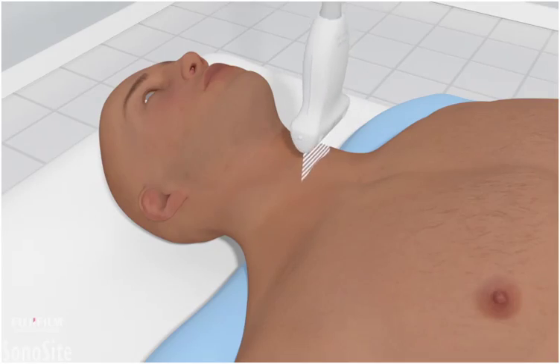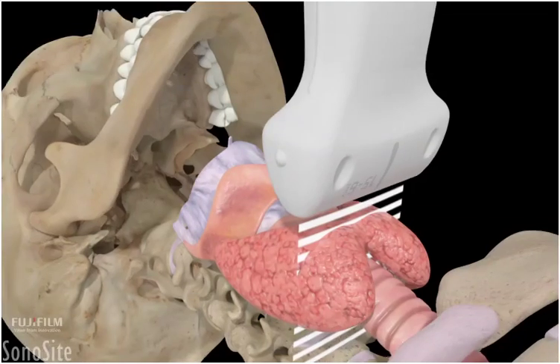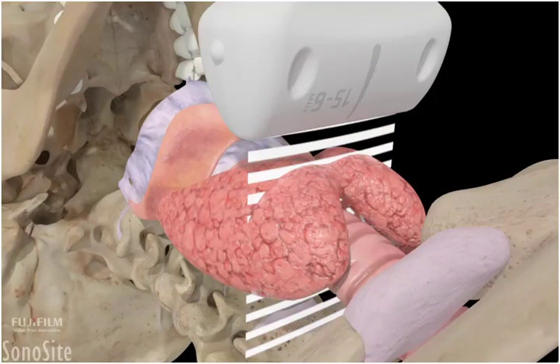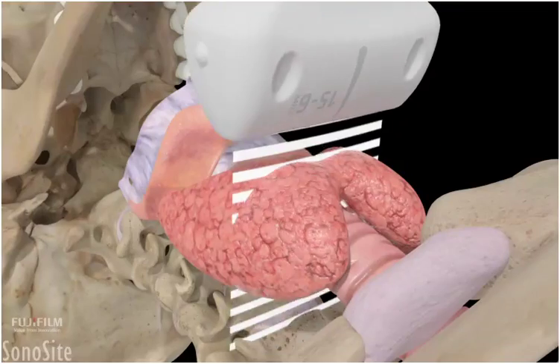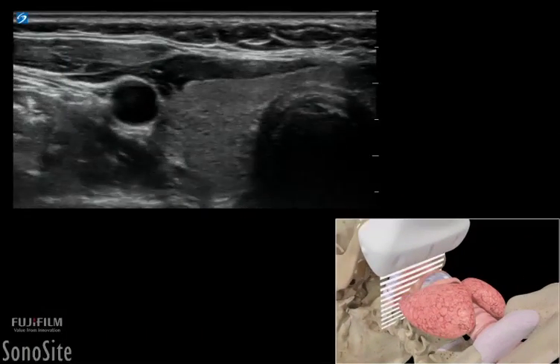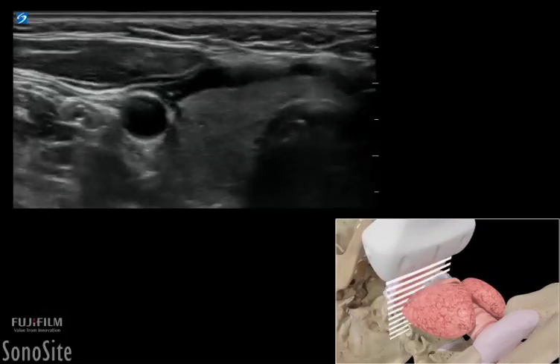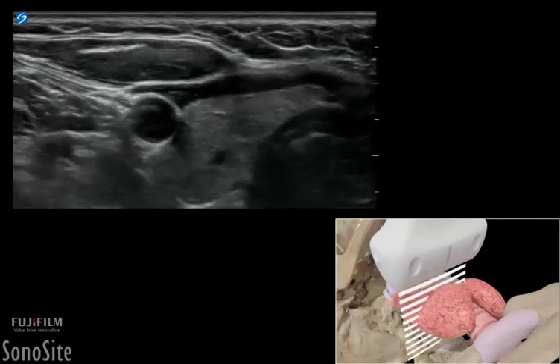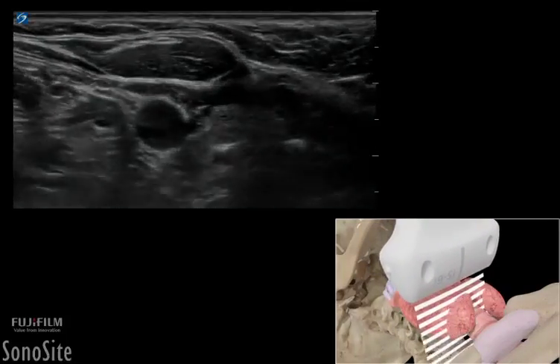The transducer is placed transversely over the thyroid region with the orientation marker directed towards the patient's right side. In transverse, start on the patient's right side. Sweep through the entire gland and isthmus cranially to caudally, from top to bottom.